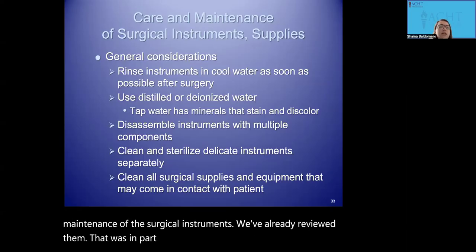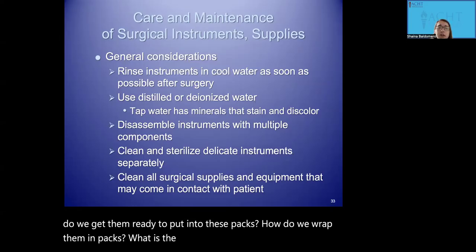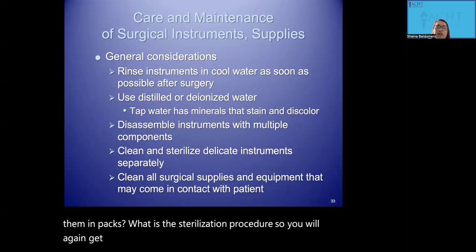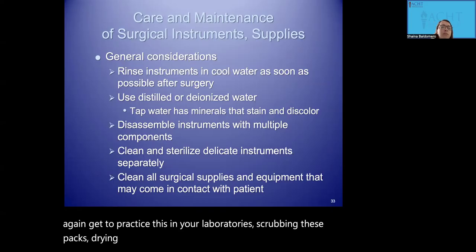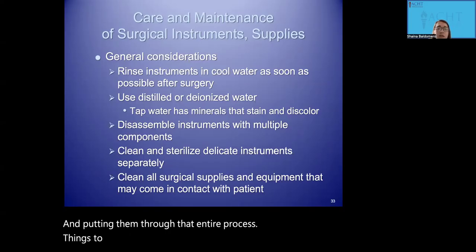So now we're going to look at, again, how do we get them ready to put into these packs? How do we wrap them in packs? What is the sterilization procedure? So you will again get to practice this in your laboratories, scrubbing these packs, drying them, and putting them through that entire process. Things to know, general considerations.